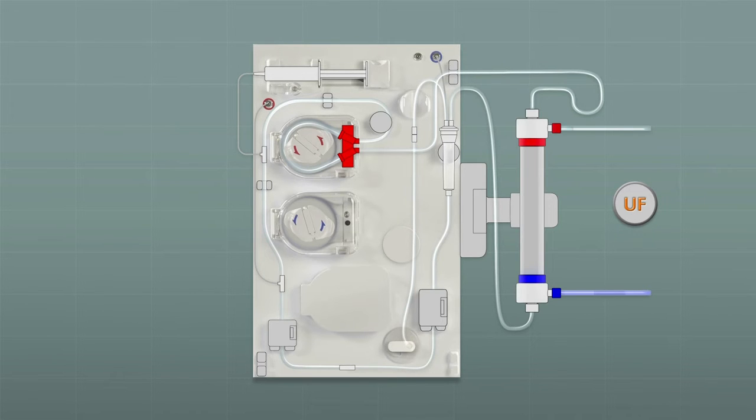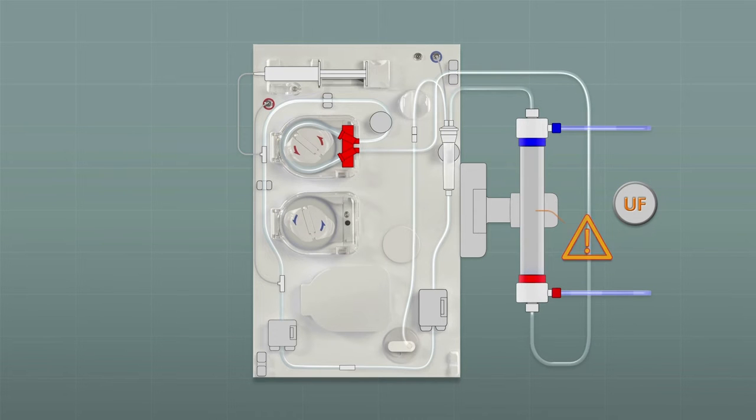First the dialysate compartment of the dialyser is filled with dialysate. Then the dialyser is turned with the blue side up. The dialyser leak check is performed.